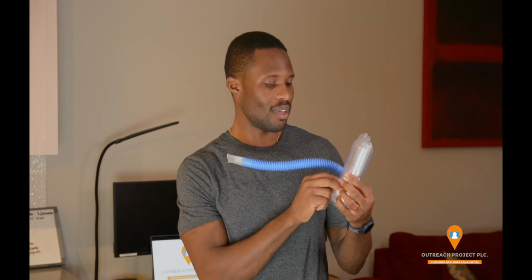Setting that target eventually to 1,500 is really beneficial, because once they're able to get to 1,500 milliliters, then they can produce an effective cough and clear out their lungs. Next, depending on how high they go, you can change it and dose it so that they can meet specific targets for whatever reason you want.